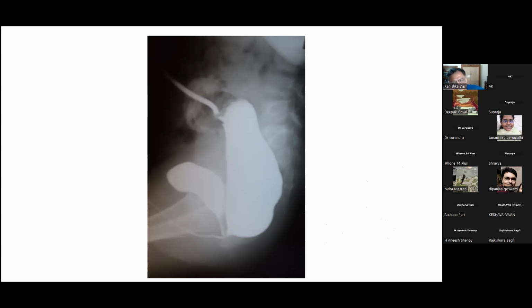So what are your observations on this anatomy? How will it influence your treatment planning? You do the study to help you in your surgical procedure, no? So in this film, we will have to observe for the length of the distal limb and also the level, the lowermost level and the beaking, and also if there is any filling in the urethra or the bladder, if there is presence of any fistula, and the relation with the sacral vertebra at the level, sir.